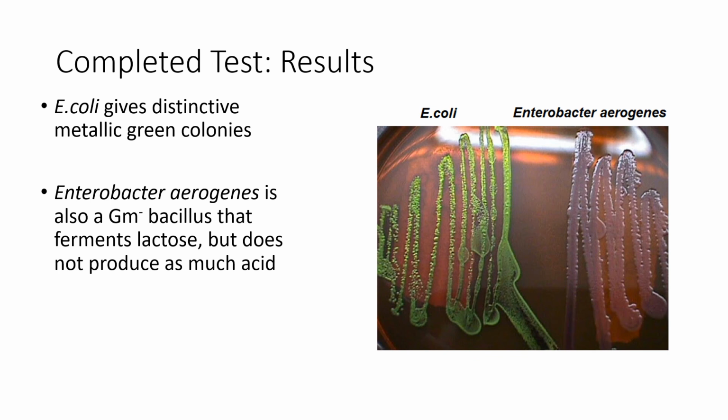It's incredible. You cannot mistake this. These are the best tests when you just look and it's like, yes, there it is. Not like you're rooting to get E. coli, okay, in your sample, but it's not one of these tests where you're like right on the cusp. I don't know. Is it a yes? Is it a no? This is so obvious.